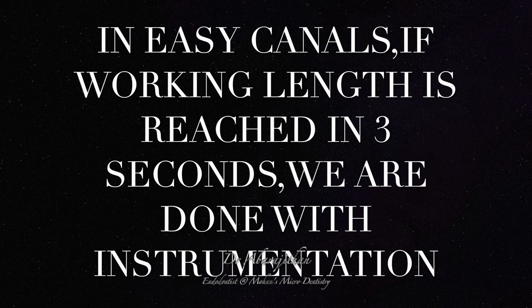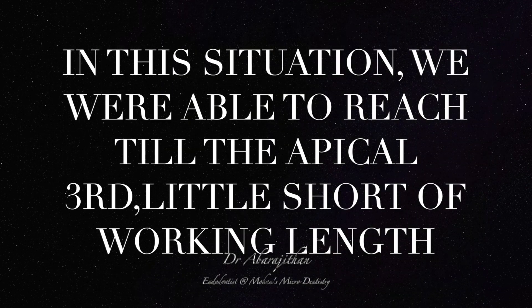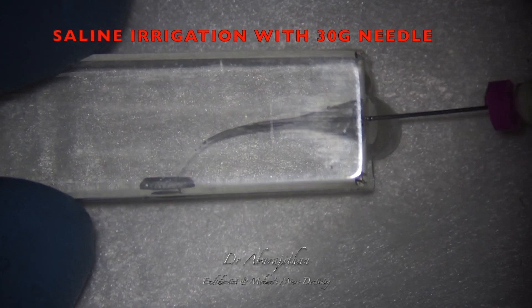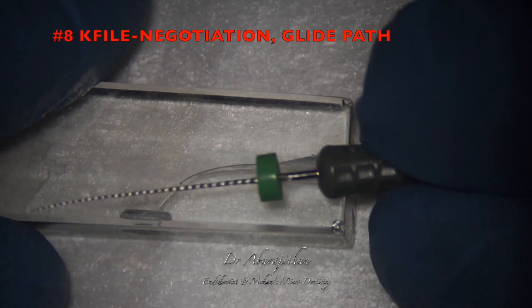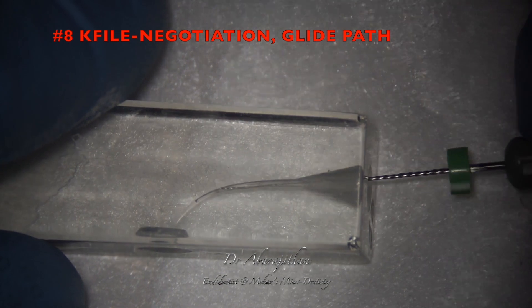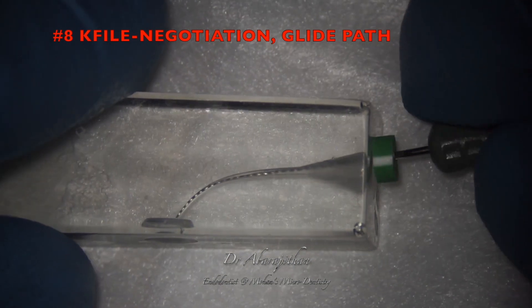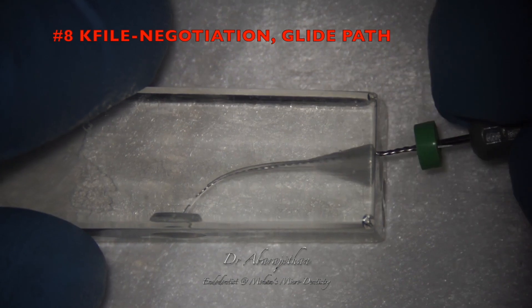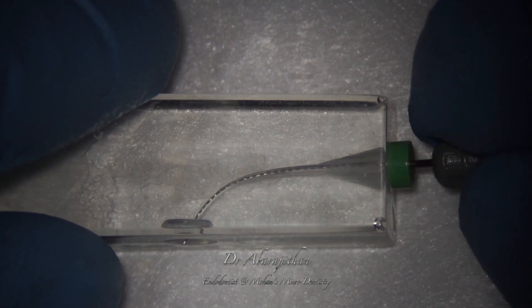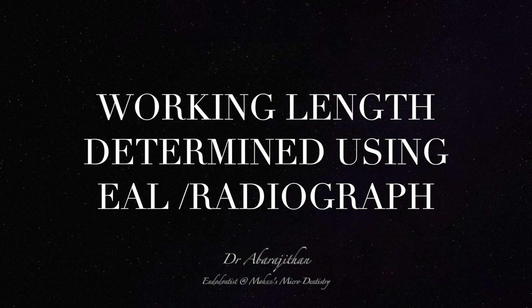But in most situations, like in this particular demonstration, the file reaches the apical third but not the working length. We stop at this stage and copiously irrigate with saline and the 30 gauge irrigation needle. Now for the first time we are going to use the 8 size K file. The first motion used is a watch winding motion which will help the file reach the working length. We establish apical patency, following which a gentle up-and-down motion is given to ensure a smooth glide path.